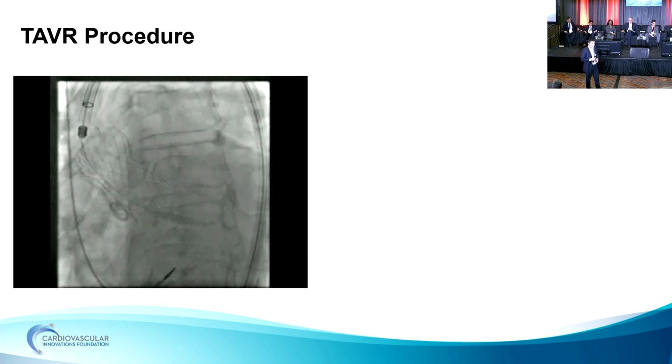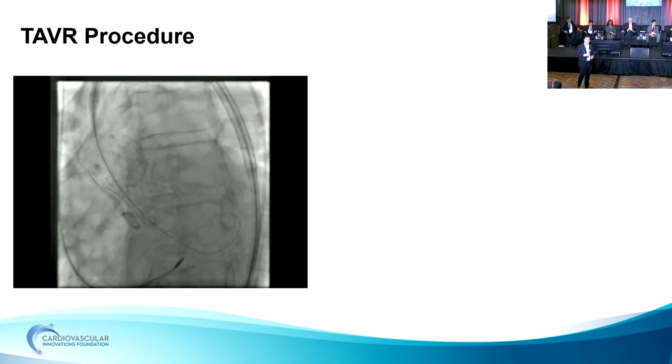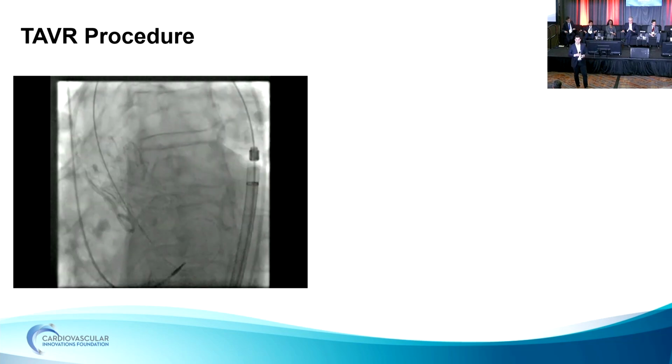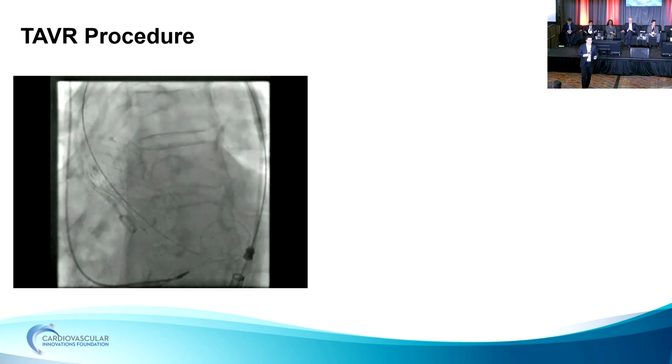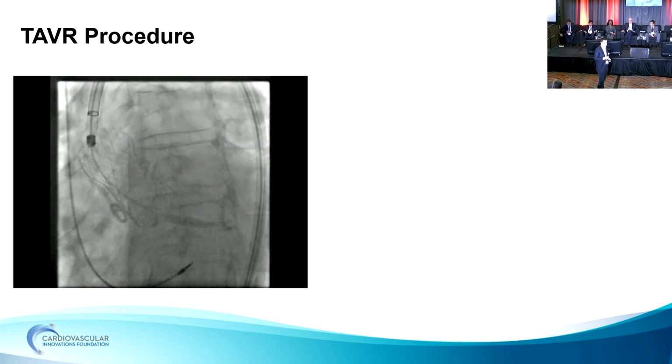We're pretty happy, get the valve delivery system out of the ventricle, leave our wire, get everything back, and that would be a nice, easy, straightforward case, and I would not be sitting here with you today giving this presentation if that's where it stopped.